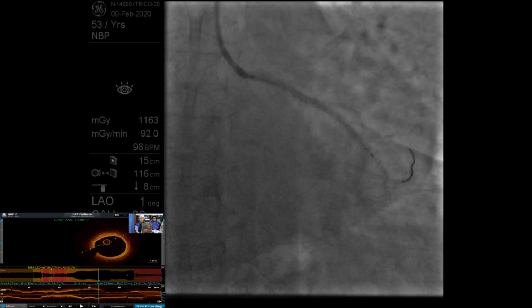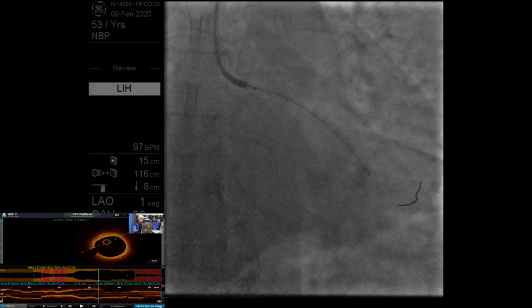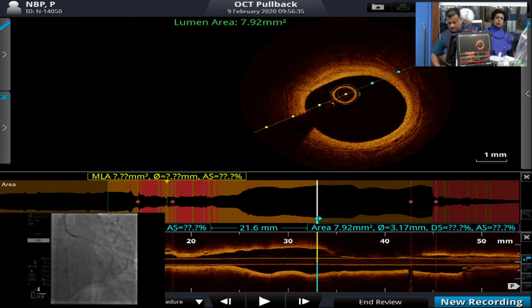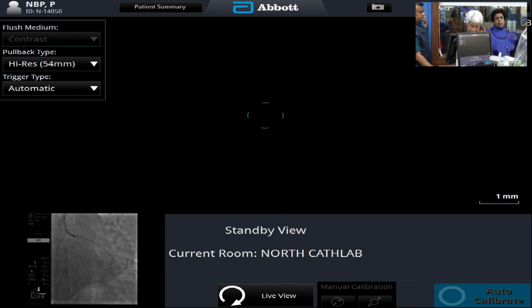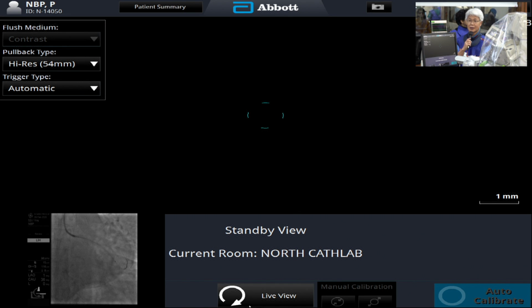Dr. Akasaka, does the intracoronary nitro help here in sizing the stent? Just after check pre-dilation, we give intracoronary nitro once. Does intracoronary nitroglycerin help in sizing the stent in this type of situation? Yes, to avoid the spasm, yes. We can size the stent to the proper diameter. Yes, I agree.